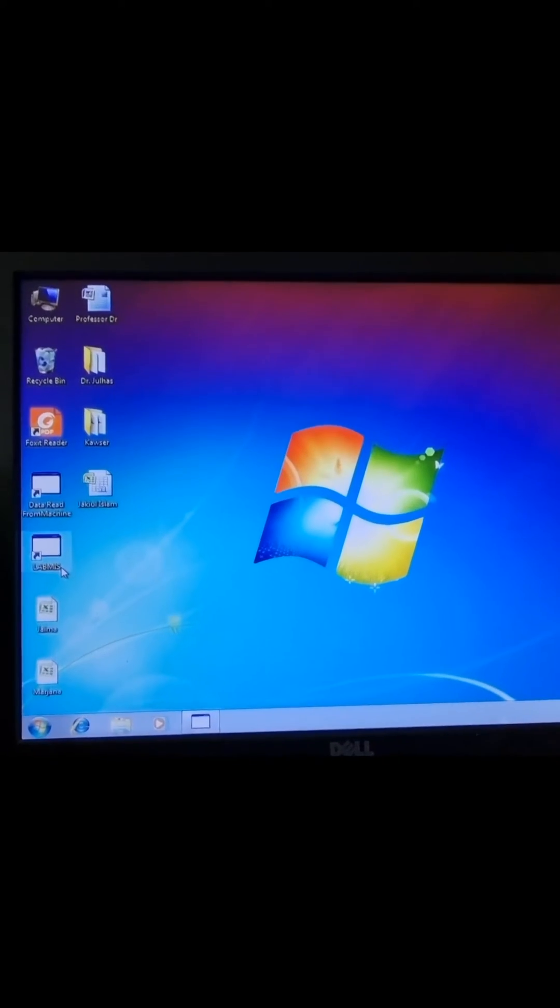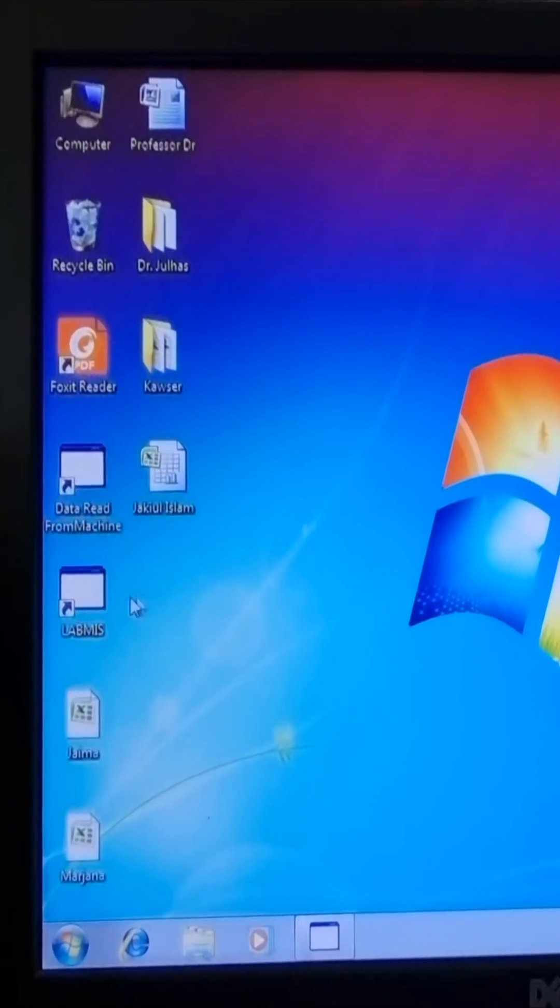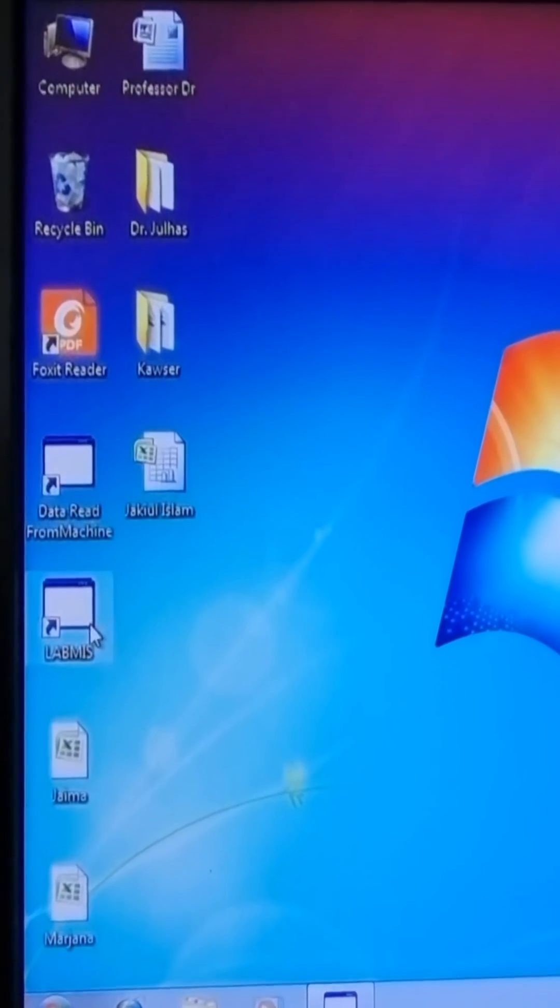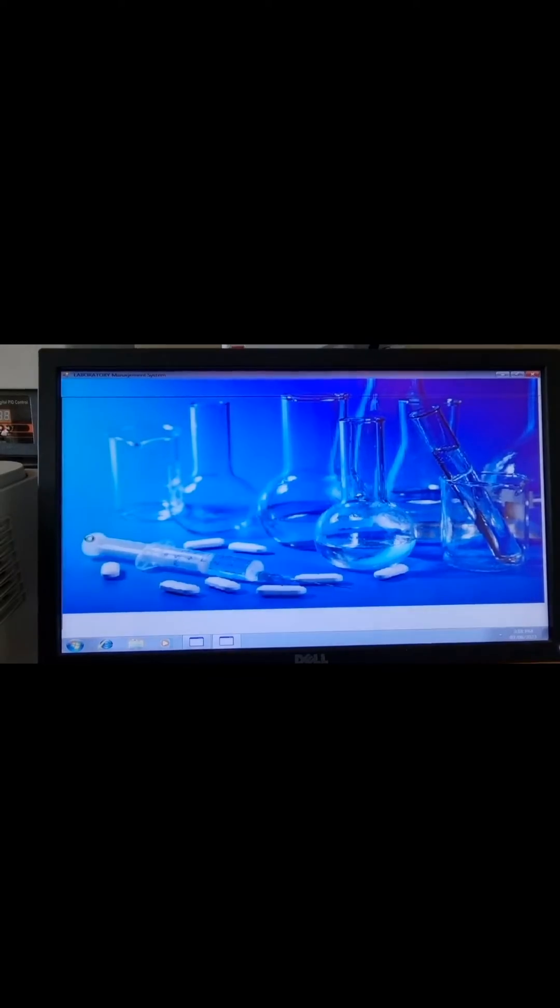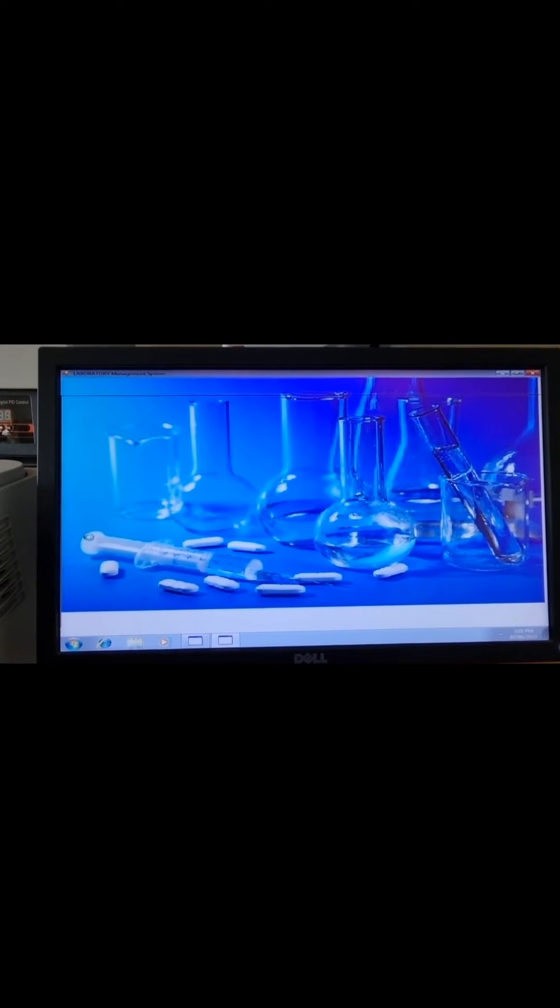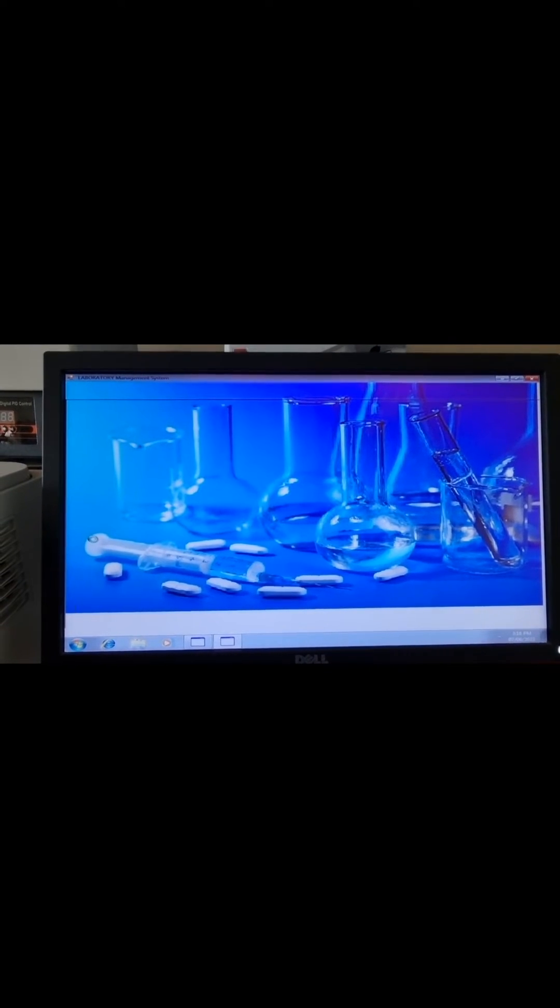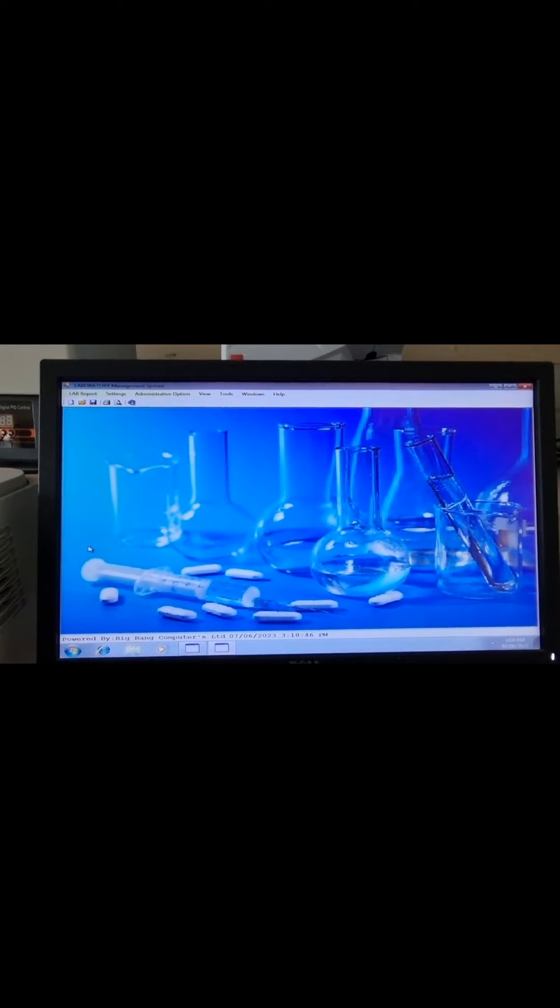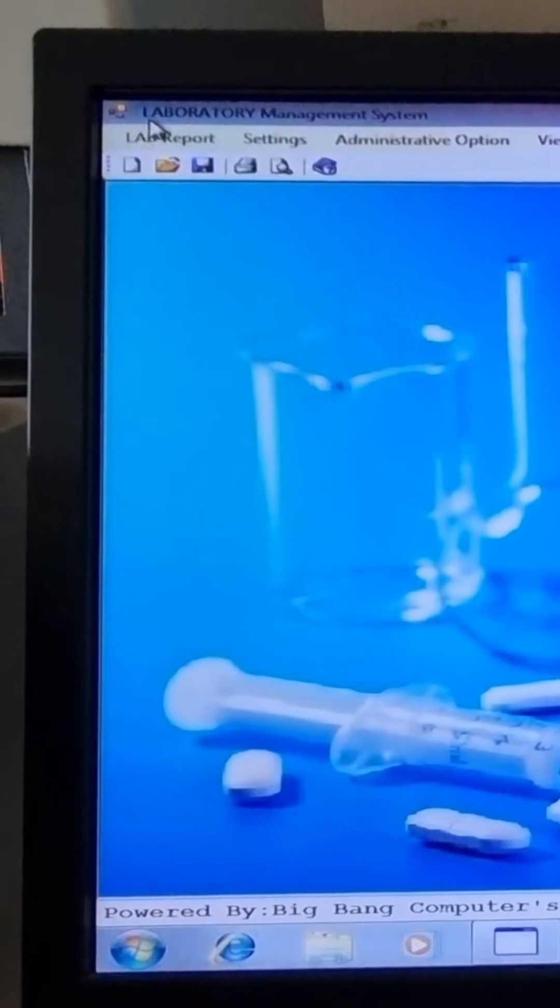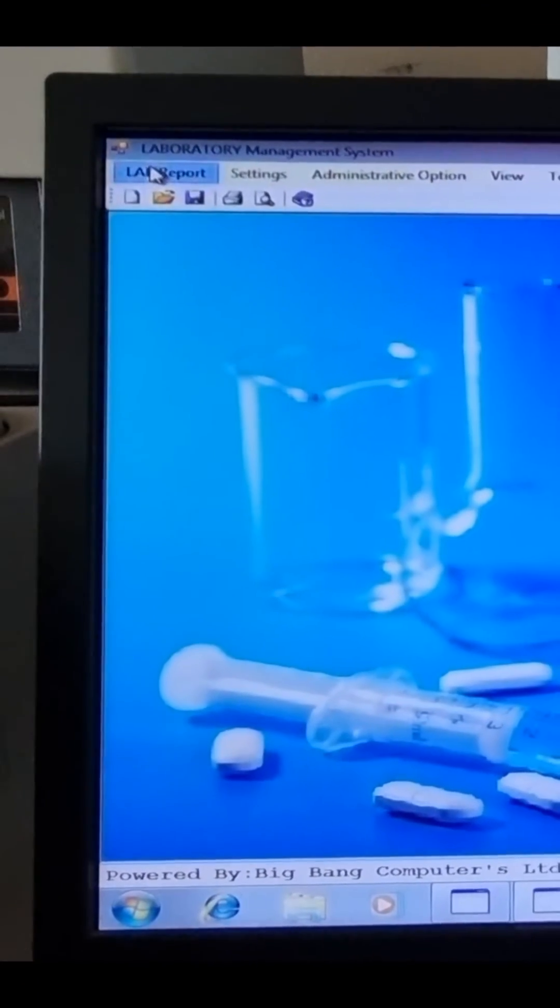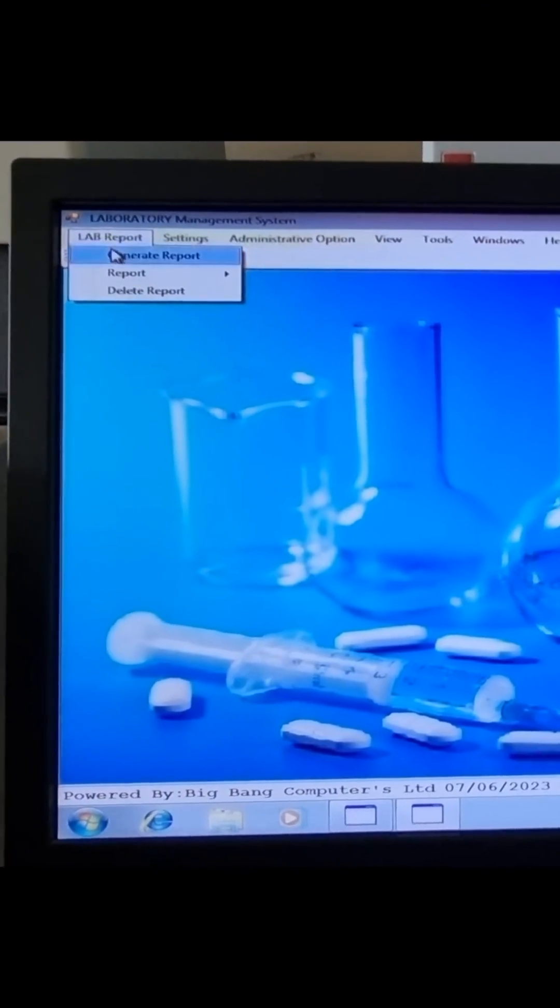Following that, we will open the LABMIS shortcut on our desktop. Then we will press the lab report button to reveal the generate report button.